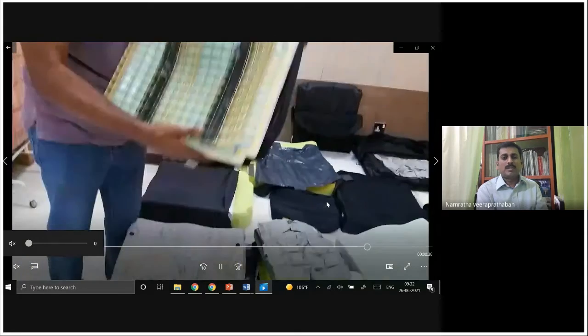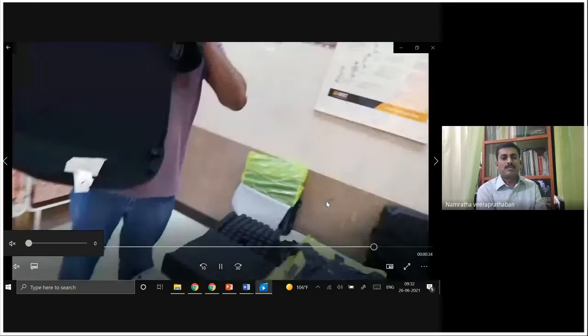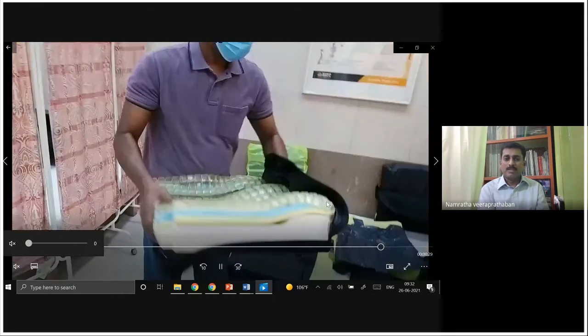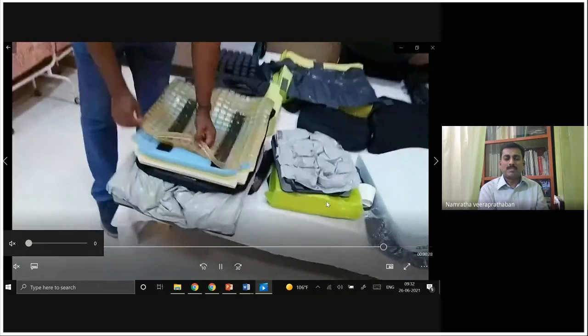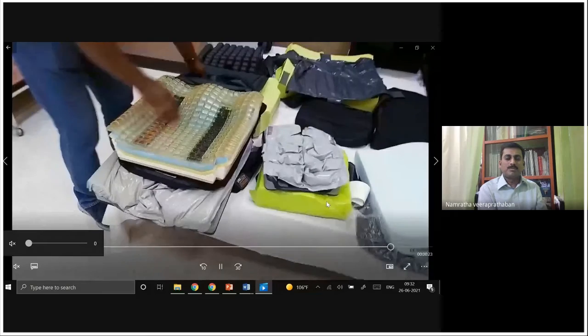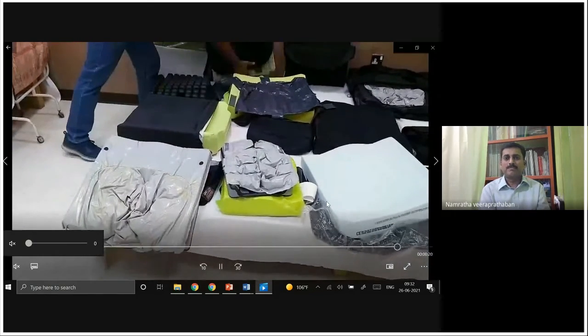These cushions can benefit people who are really at risk of skin breakdown and have poor cognition, so the weight shifting skills are not going to happen. For them, if they are sitting more than 7 or 8 hours in a day, these cushions will really help them take care of the pressure, and provide comfort, everything.